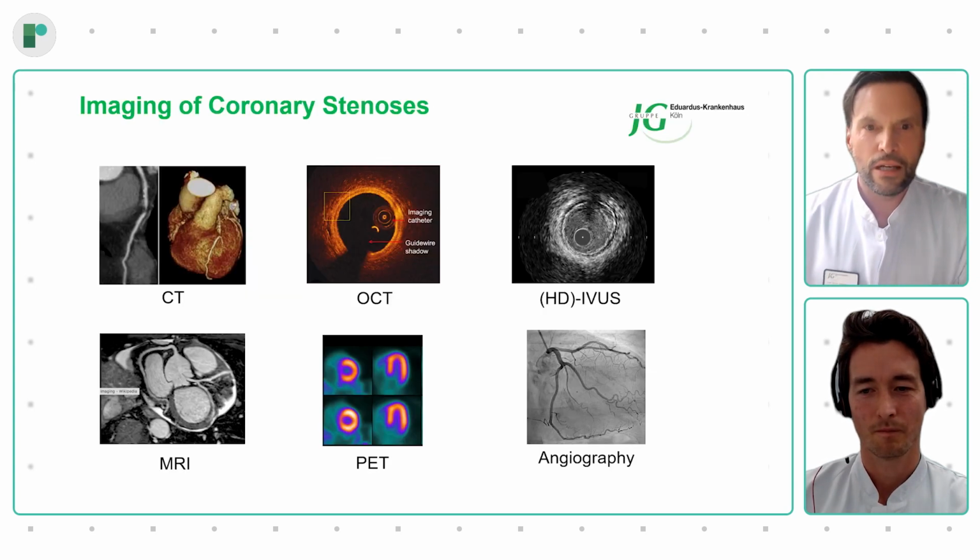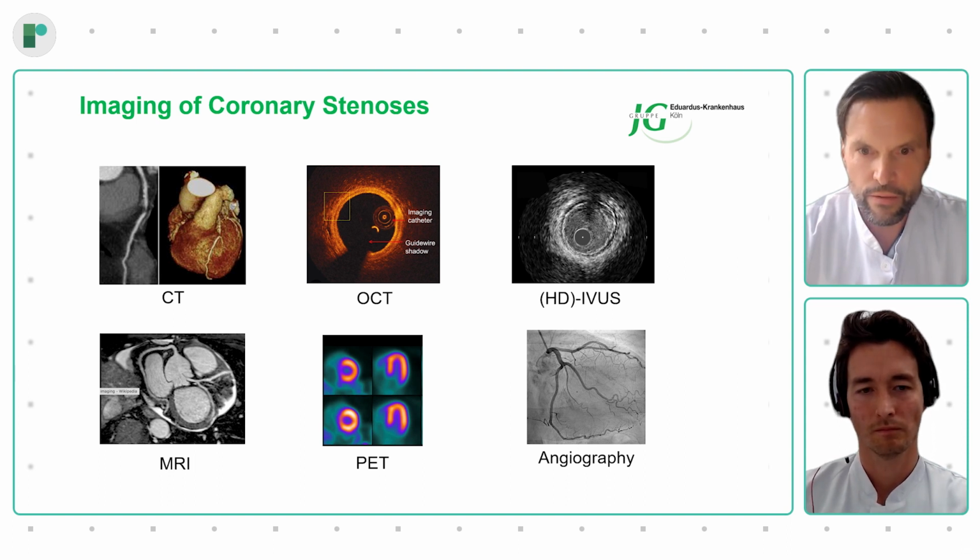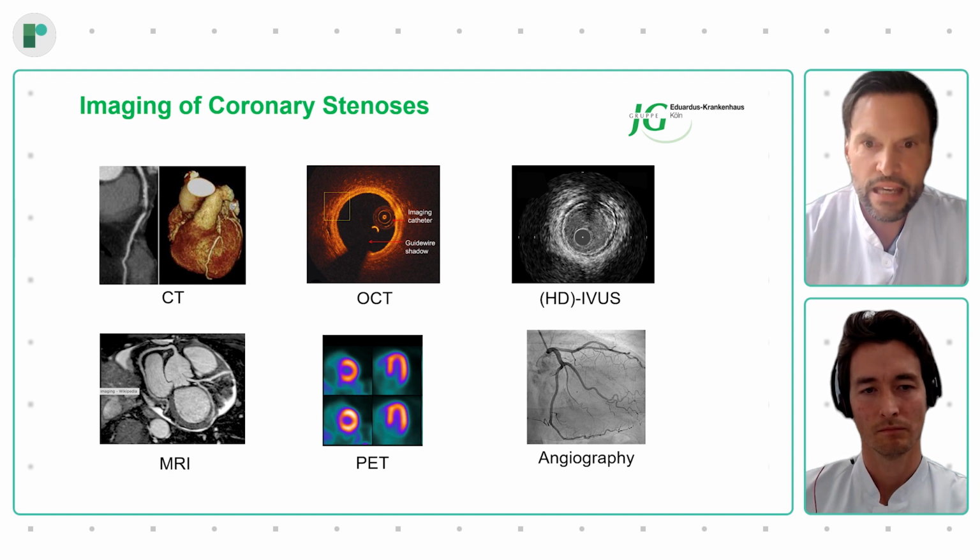So if it comes to imaging of coronary stenosis, I think every one of you will know that there are several different imaging modalities that we can use and that are used in daily clinical practice or routine. And of course, every imaging modality has its place in an interventional workup of patients. We want to focus here on intravascular imaging, which is, of course, different from hemodynamics. And maybe we can discuss this issue in our live cases or in our recorded cases.